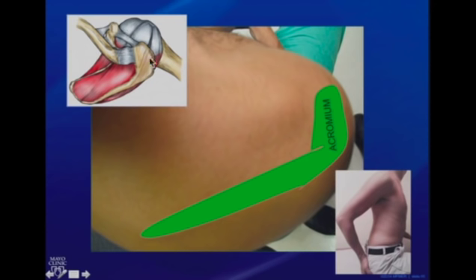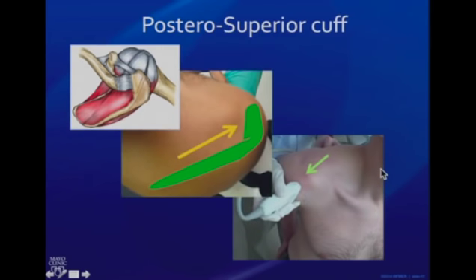So this is a good view to memorize, to understand how the tendon will look once you make the patient go into a modified CRAS position, because once you are bringing this shoulder back, what you're doing is pulling out this tendon to be in full view. So now imagine that you are scanning the patient in the modified CRAS position, you are looking for the tendon as it tries to come out from under the acromion.